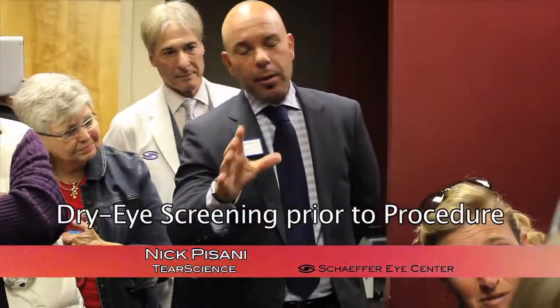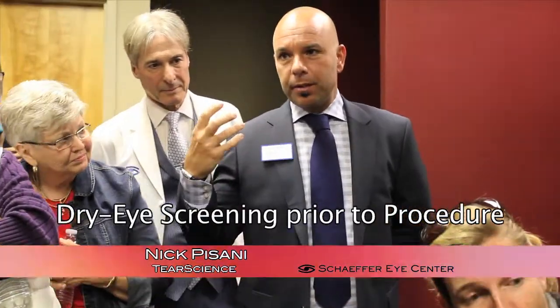This test is really doing two things. First of all, it's allowing the patient to see what the doctor sees. This is one screening that a doctor will do during a whole dry eye evaluation. This technology called LipiView is doing two things. It's showing the doctor the quantity of the lipid or the oil, and it's also testing for partial blinks.